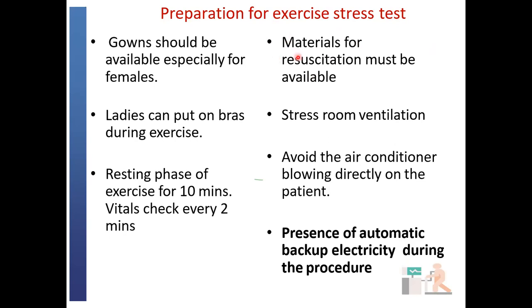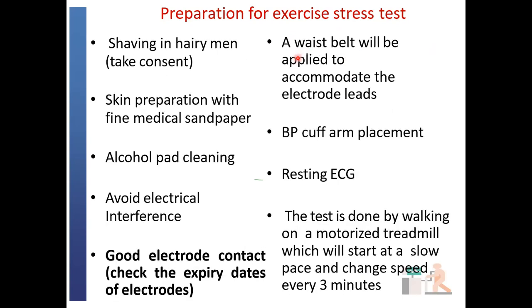So materials for resuscitation must be available. The room ventilation should be adequate. Avoid an air conditioner blowing directly on the patient. And there should be an automatic backup electricity supply during the procedure.